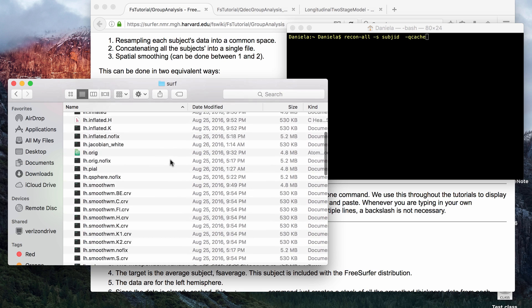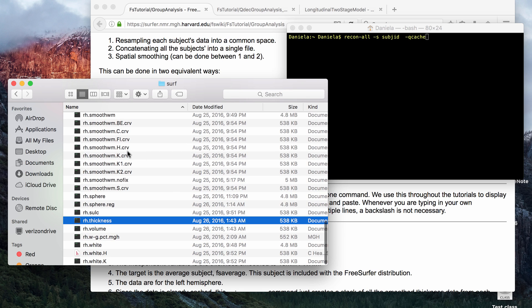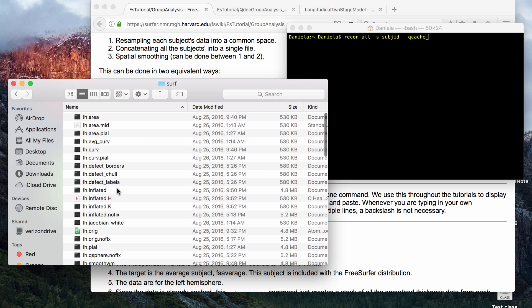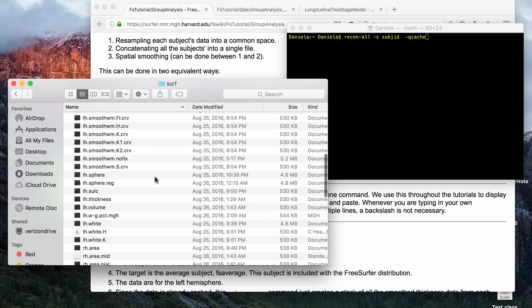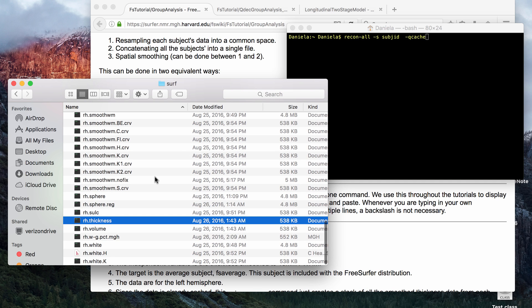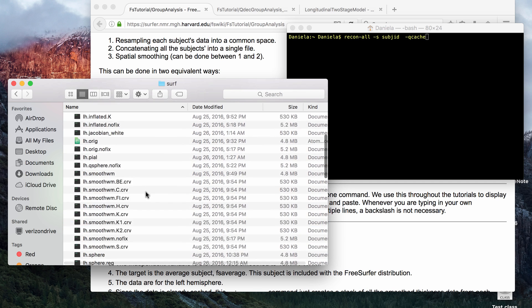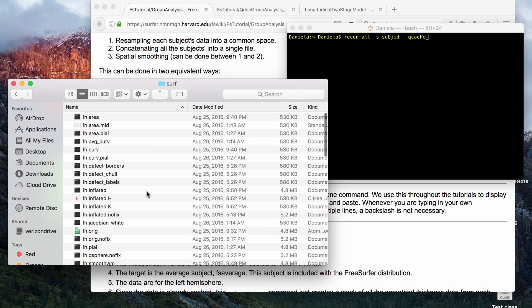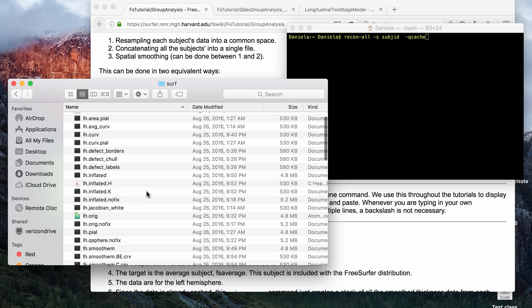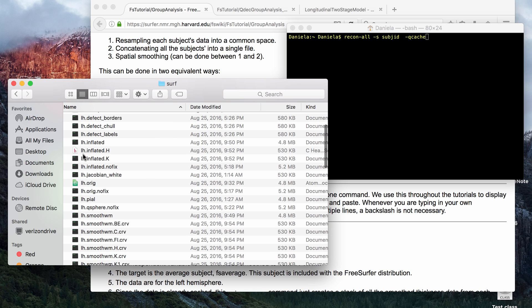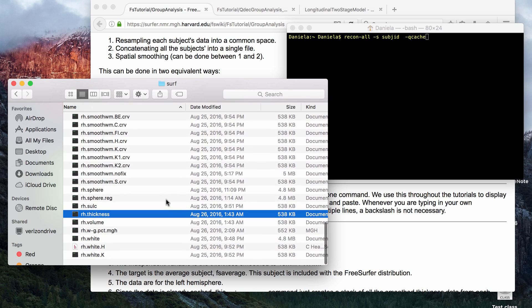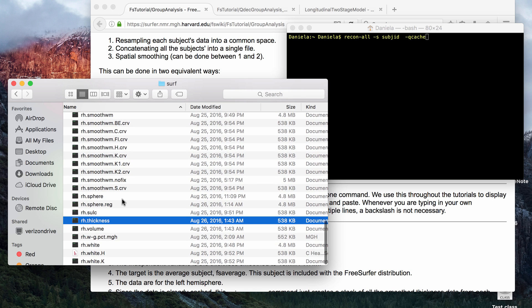What this does, basically, this is an example of a surface folder from a subject who has not had the Qcache command run. You see, for example, that these surface files, there's always a left hemisphere surface file and an equivalent right hemisphere surface file.